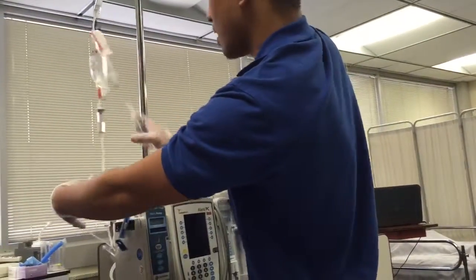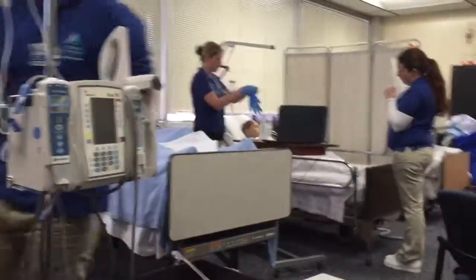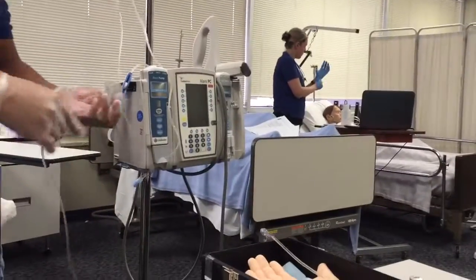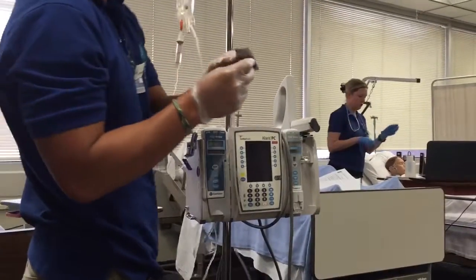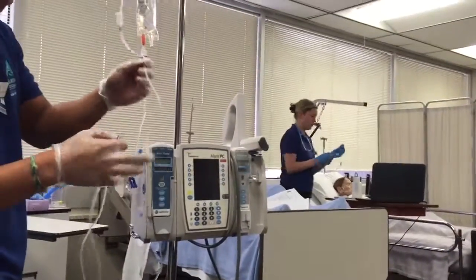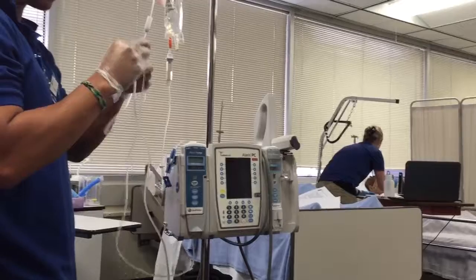So that's that. Now I'm going to take an alcohol swab and cleanse the port. I'm going to go ahead and use this port right here. So I'm going to go ahead and cleanse the site. And I'm going to set the drop factor for the piggyback at 17 drops per minute. I'm going to cleanse that. And then I'm going to connect my piggyback. It's still clamped. I'm going to go ahead and connect my piggyback to this line.